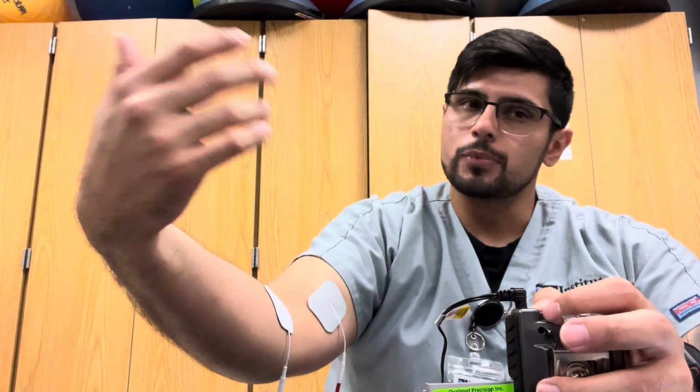All right. So once that's on there, you're gonna go ahead and come onto the knob, and then we're gonna go with the amplitude. So now with the amplitude, it's a little different for everybody, right? So this is gonna vary per patient. So you go ahead and turn the knob nice and slow, and they should be feeling like a tingling sensation, right? Nice and easy. And again, they're kind of in control of this too, right? Because it's dependent on patient by patient. What you don't want to see is muscle twitching, right? If the muscle starts twitching, it's too strong, right? So you're going to go ahead and back that down until they feel more of that tingling sensation, right?